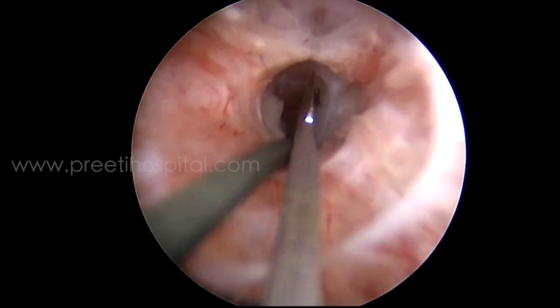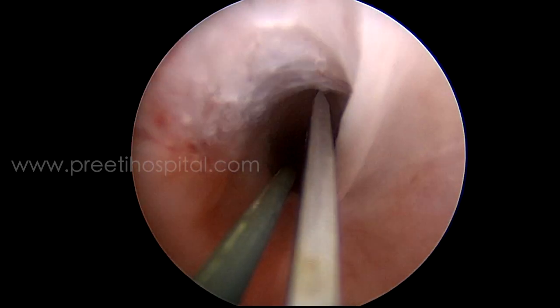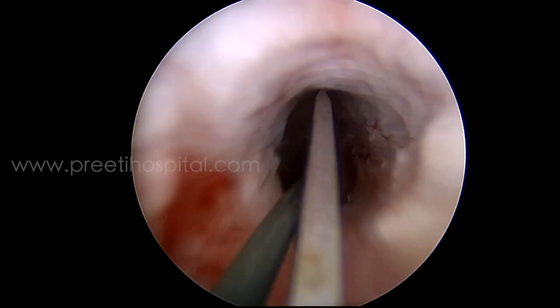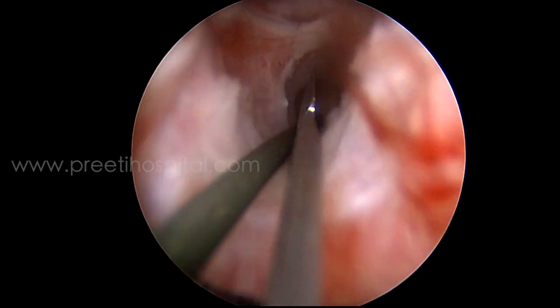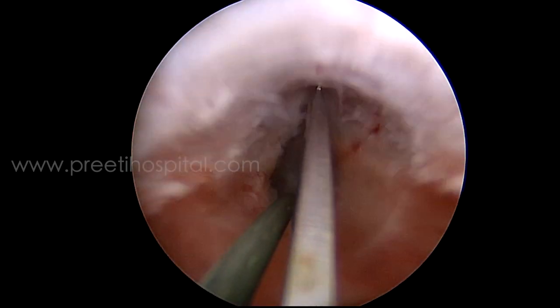One clean cut will be helpful. This surgery anyway will not help the patient long-term, so we should not damage more tissue. Here, if you see, the guide wire is going down. If the guide wire were not there, you might have cut above the correct plane. The second point is that there are two accessory tracks visible.